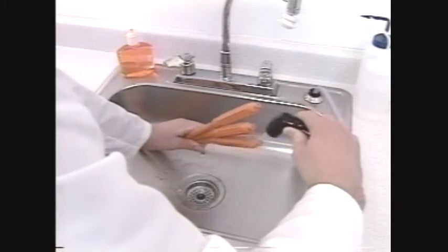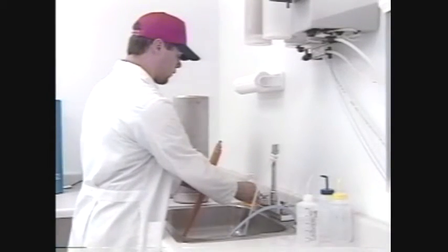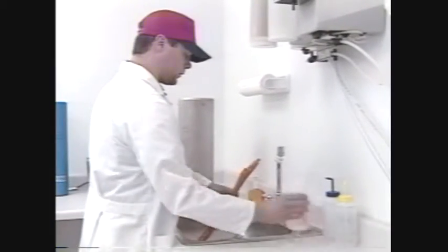Immediately after use, wash the catheters thoroughly in hot water. Water should be flushed through the shaft of the catheter and all traces of mucus and other debris removed from the outside of the catheter. After washing, rinse the catheter thoroughly with clean water, using purified water for the final few rinses.